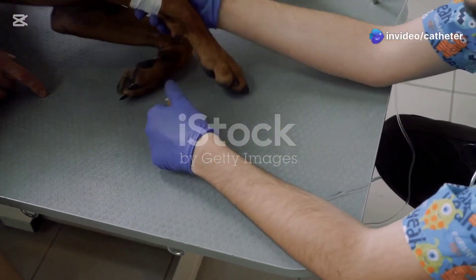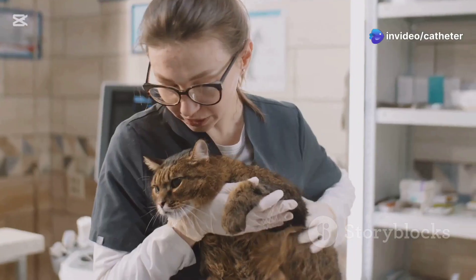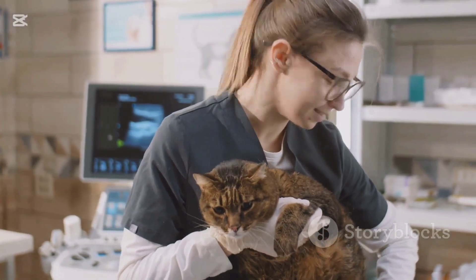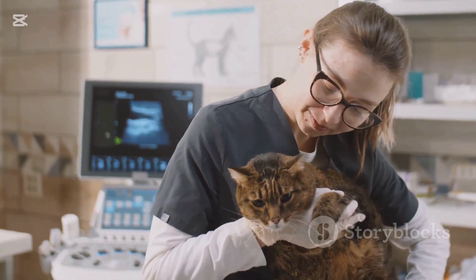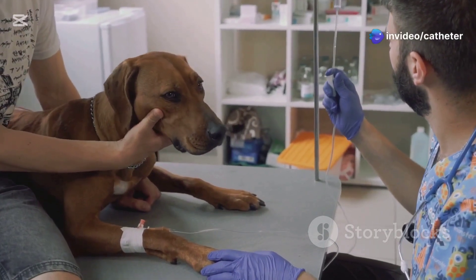Now let's talk about preparing your patient. The key here is to keep them calm and secure. For small animals like dogs and cats, having an assistant to hold them gently but firmly is super helpful. For larger animals, proper restraint is crucial — you don't want them moving around during the procedure.